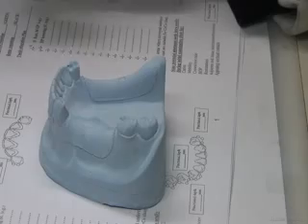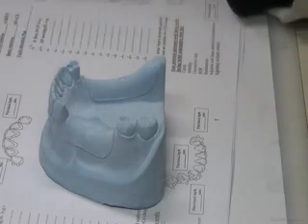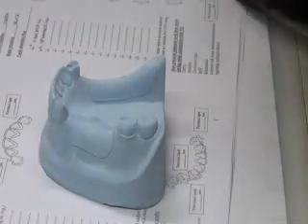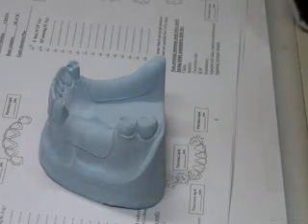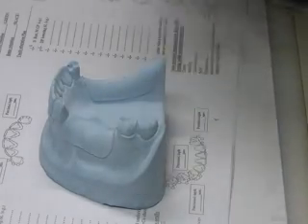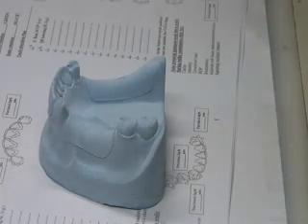Why? For aesthetics. This is design. This is what we mean by design. We change the very basic design based on some findings. One of the findings is that our abutment is a canine. So the C-clasp, the circumferential clasp, what did we change it to? An I-bar for aesthetics. Okay, and what happened to the reciprocal arm? Where's the reciprocal in our design? We eliminated it altogether. We did not put a reciprocal arm.